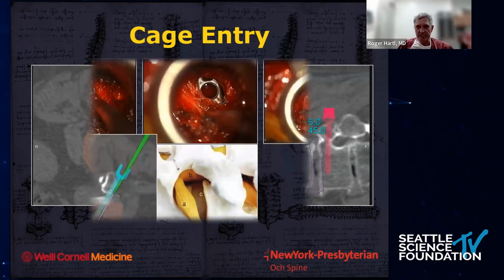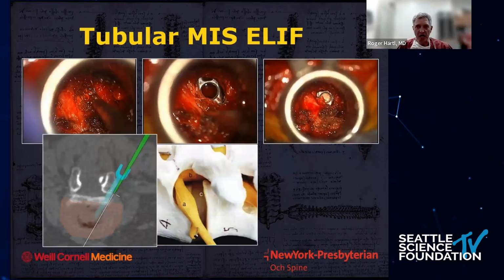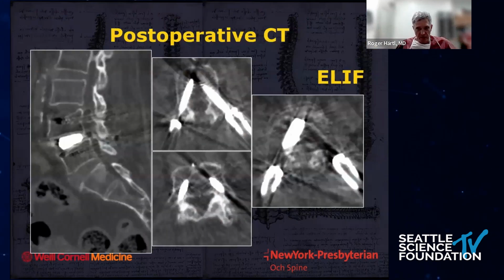So then I do the discectomy, and then you see the exiting. This is coming in from the left side at 4-5, I think, and you can see the exiting nerve root here. So obviously you're trading one complication against the other. You don't see the dura, but you've got to be really careful with this exiting nerve root and with the DRG, that you don't manipulate that too much. So that's the complication that you're trying to avoid when you do this operation. And you've got to be careful, obviously.